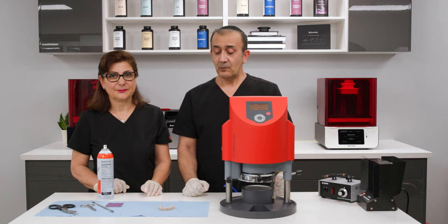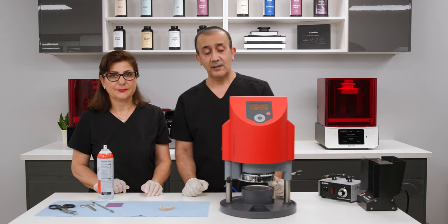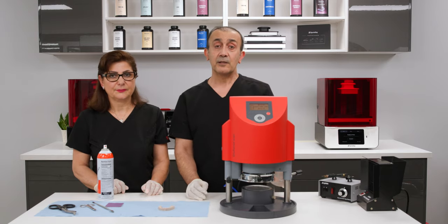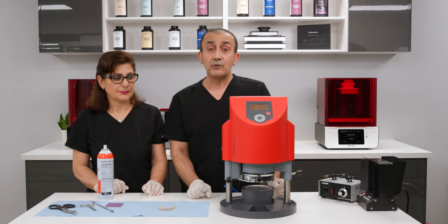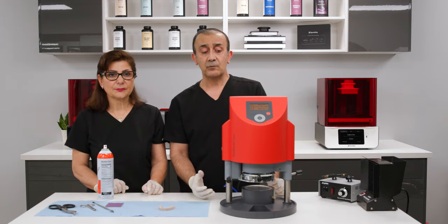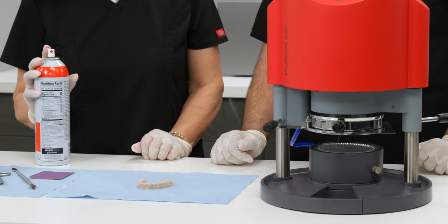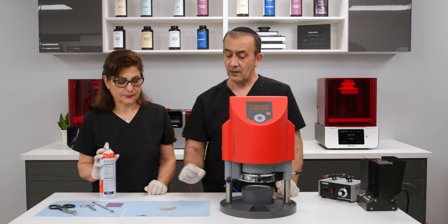Now we're ready for the vacuum forming machine. I like to use the Drufomat machine from Dreve — everything is automated, just do a barcode scan and the machine sets the parameters automatically. Another great machine is from Great Lakes Biostars. I don't recommend using an over-the-counter suck-down machine because you can end up overheating or underheating the plastic, affecting the fit. I recommend using a vegetable oil spray so the plastic doesn't get stuck to the model.